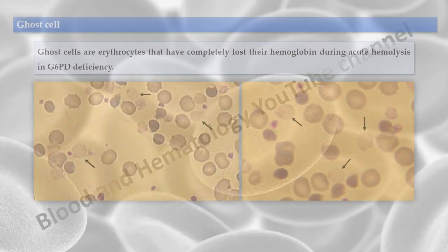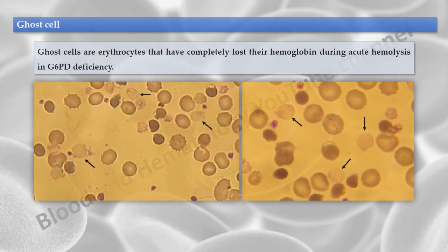Ghost cells are erythrocytes that have completely lost their hemoglobin during acute hemolysis in glucose-6-phosphate dehydrogenase deficiency.